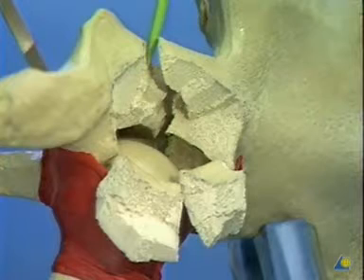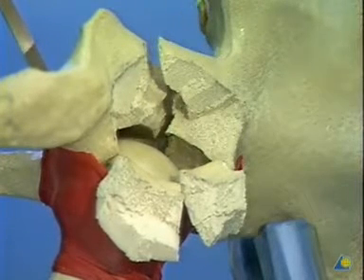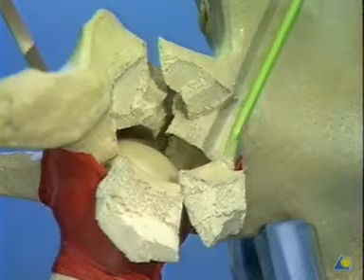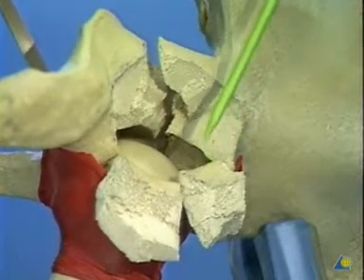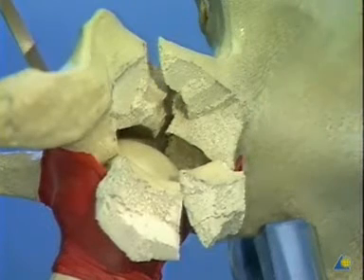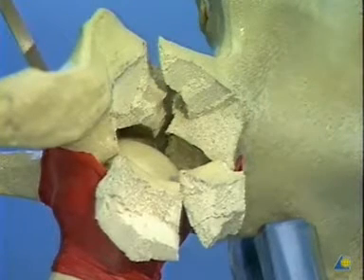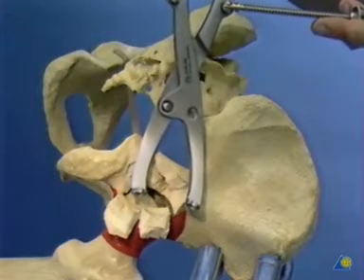The first step will be reduction of the transverse fracture and lag screw fixation. Following this, the posterior wall will be reduced and plate internal fixation across both fractures will complete the fixation. The pelvic reduction forceps will be used for reduction of the transverse fracture.